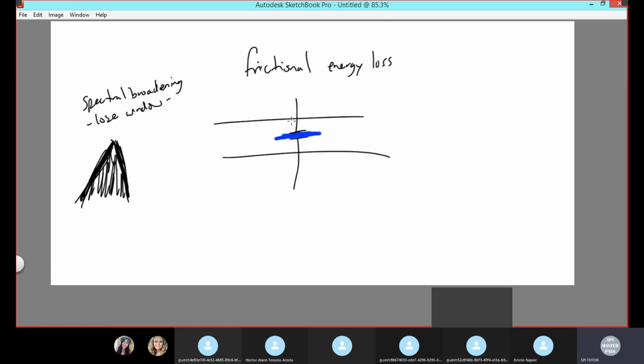Now, there's blood moving on either side. That's true. But that's the reason why it's called a sample gate, right? You're only sampling that area. You're not sampling anything else. So in the center, blood moves without any frictional loss. Okay, there's nothing holding it back.